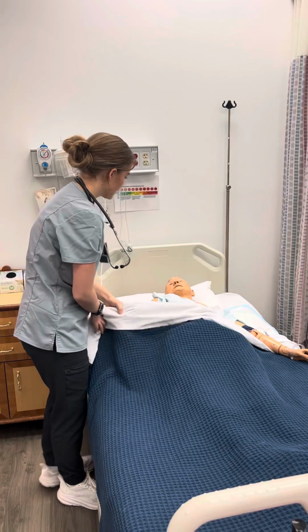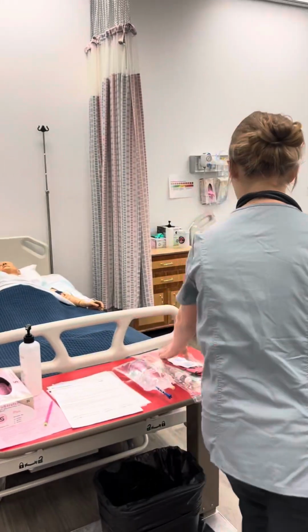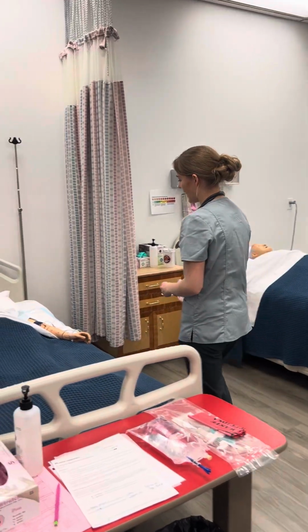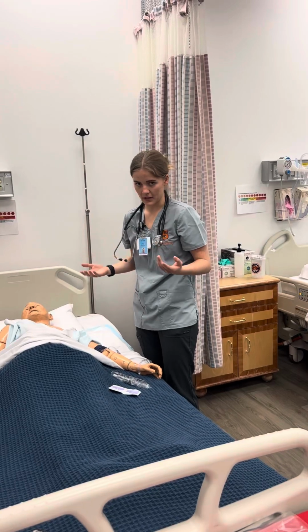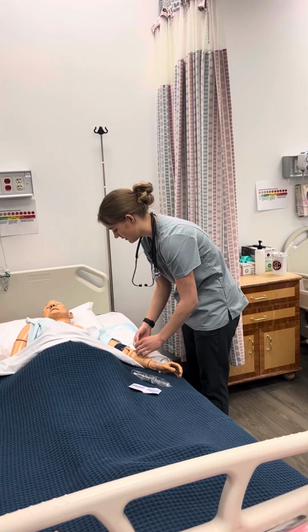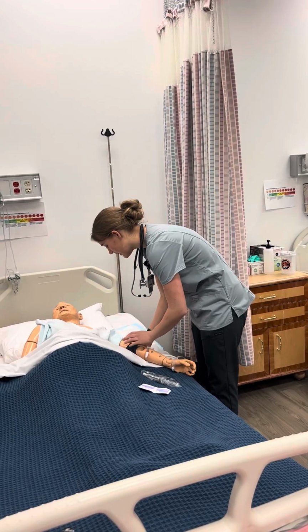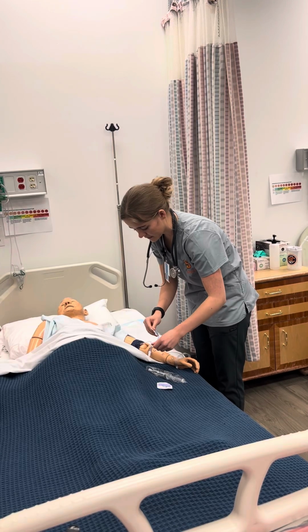Okay. And so now I'm going to go ahead and just assess your IV real quick. I'm just going to make sure that we have an 18 gauge IV. Just make sure it's big enough for the blood. Make sure we have 2 IVs for this. Okay, looking for any swelling, redness. It looks great. I'm just gonna go ahead and flush it real quick.